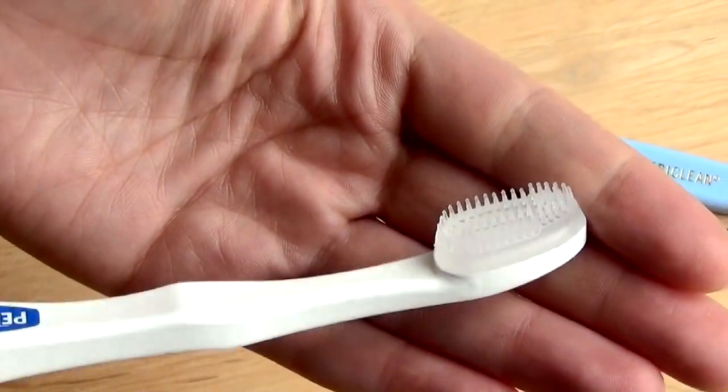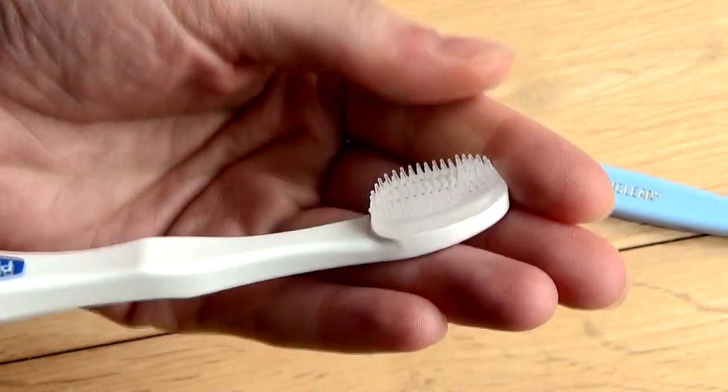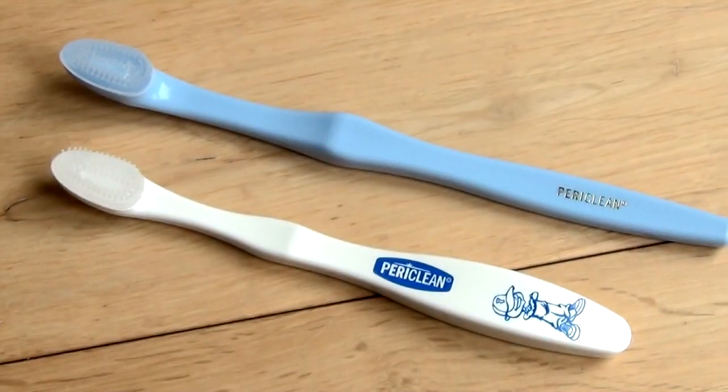The Periclean brush is also available in a smaller size for children. This can be a great choice for youngsters as they learn how to take care of their teeth.